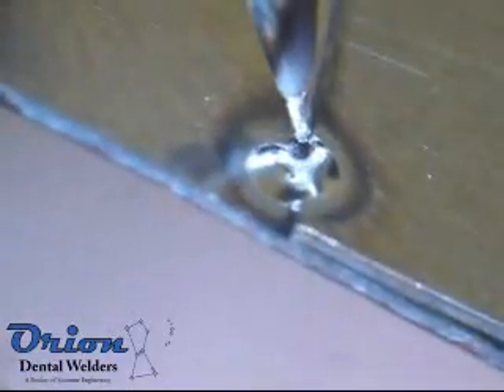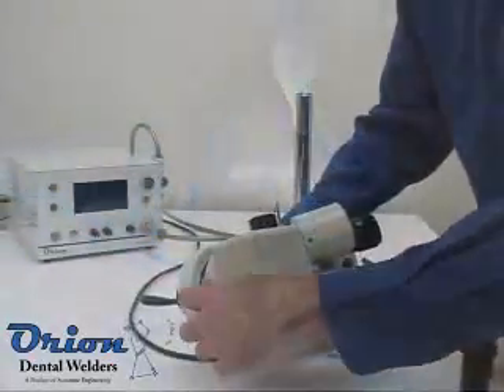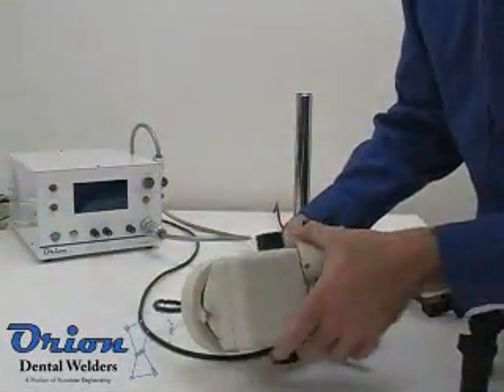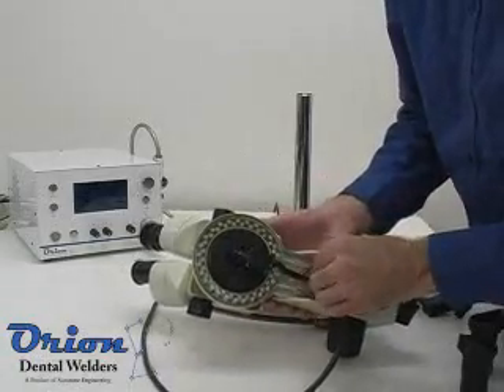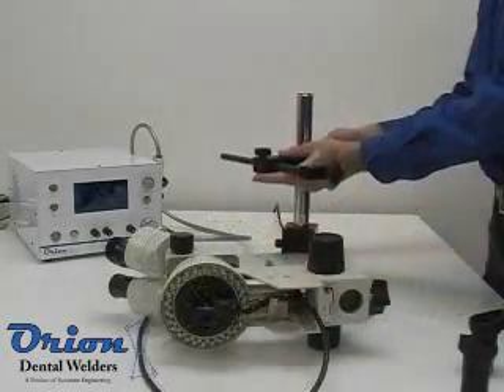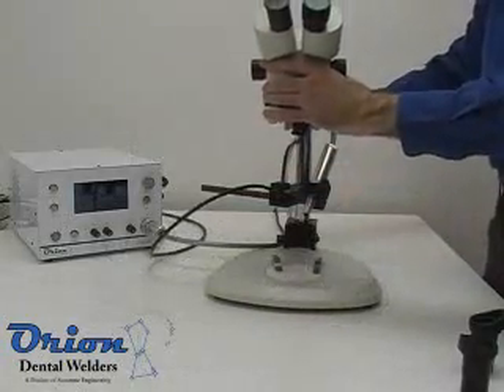The pulse arc stylus holder can be adjusted to provide the perfect welding setup. Unscrew the stop nut and rotate the optical unit into the desired position. Secure the shutter cable under the microscope cable clip. Finish by placing the pulse arc stylus holder and the microscope optics holder on the microscope shaft.